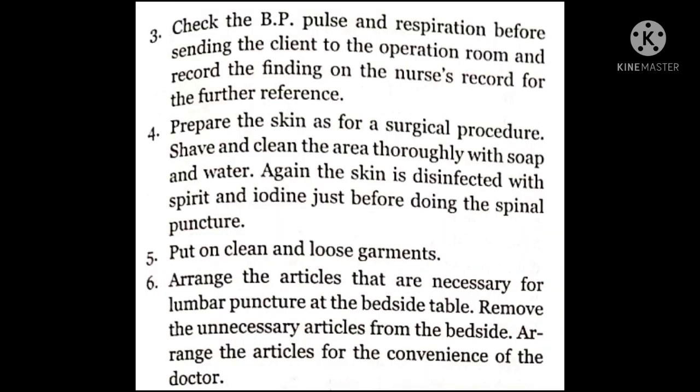3. Check the BP, pulse and respiration before sending the client to the operation room and record the finding on the nurse's record for further reference. 4. Prepare the skin as for a surgical procedure. Shave and clean the area thoroughly with soap and water. Again, the skin is disinfected with spirit and iodine just before doing the spinal puncture.